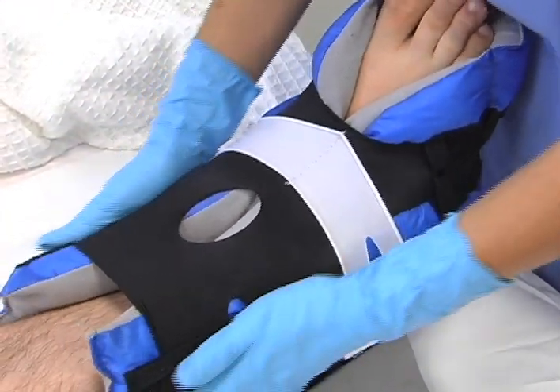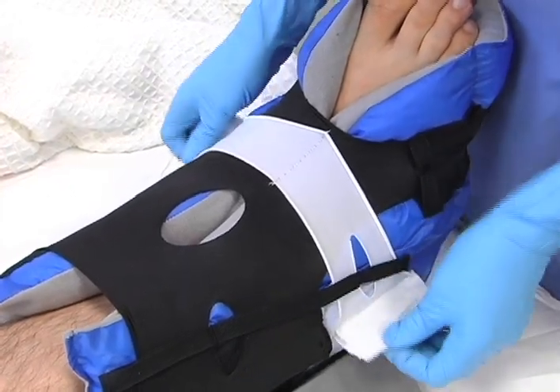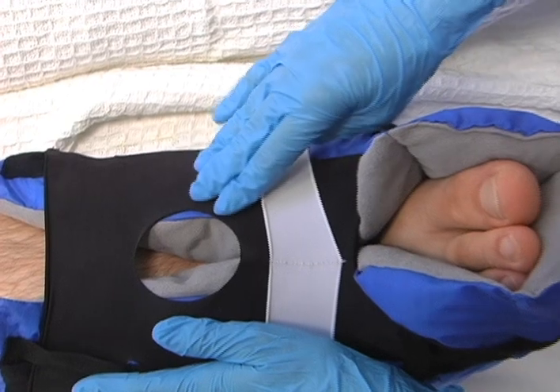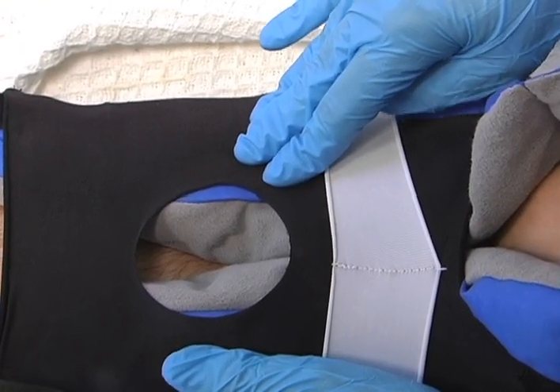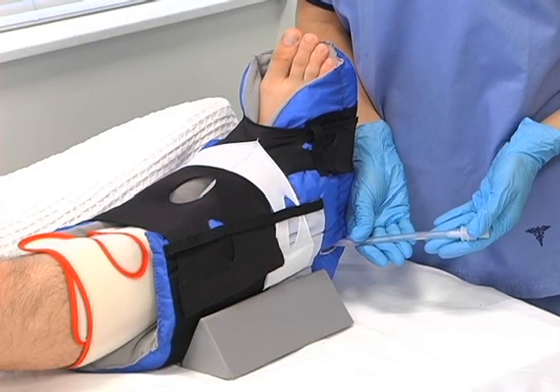The stretch panels can be adjusted from both sides to ensure a secure, comfortable fit. Check to make sure the opening in the wide black panel is centered over the shin. For boots without the additional ICD access ports, this opening is what will be used for the ICD tubing. If using an ICD, connect the tubing to the pump.